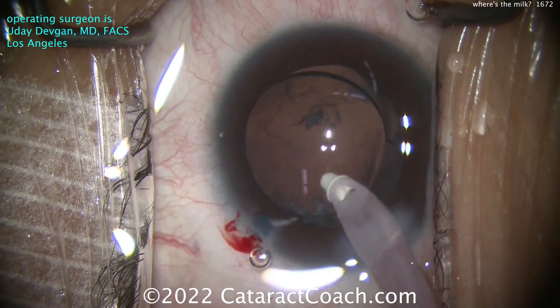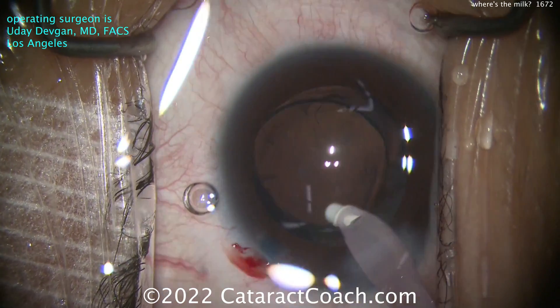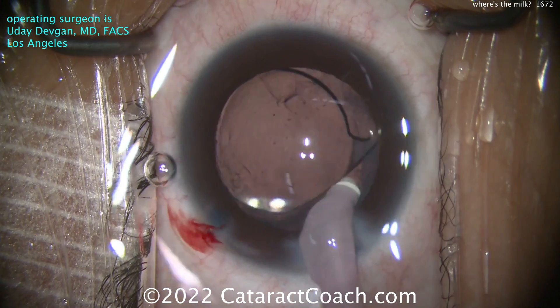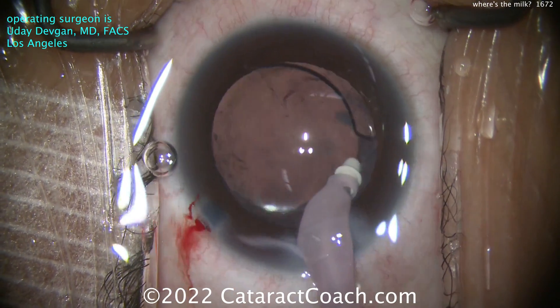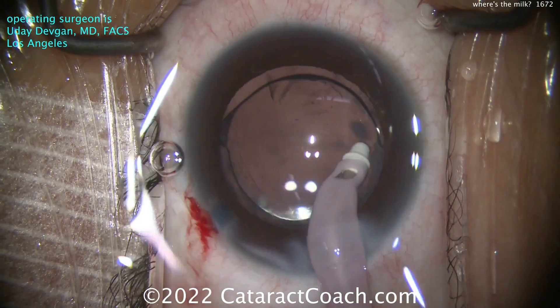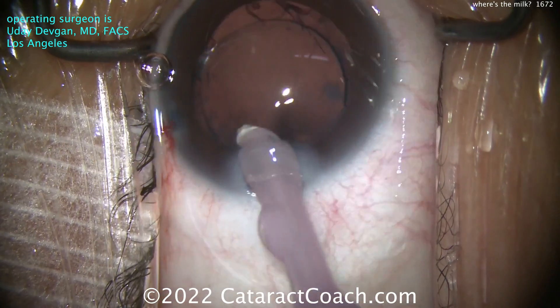I want the optic right on the capsule with all the fluffy stuff above it. Now look - I can bevel down, go into that sub-incisional space, and really clean out more of that lens cortex. Looks like this is an extended depth of focus lens as well. Wow - the patient is going to be quite happy going from a white cataract and seeing nothing to having a pretty wide range of very nice sharp, clear vision.